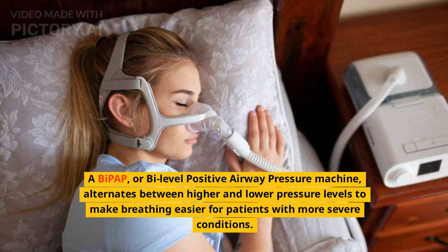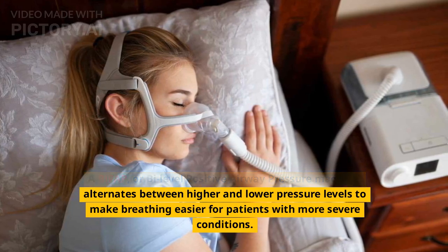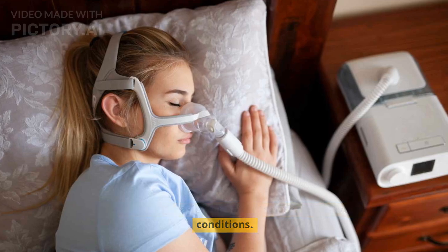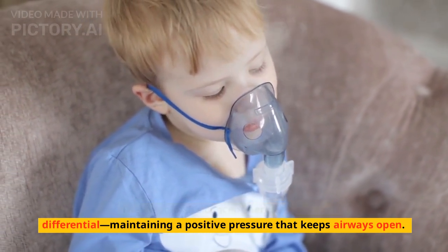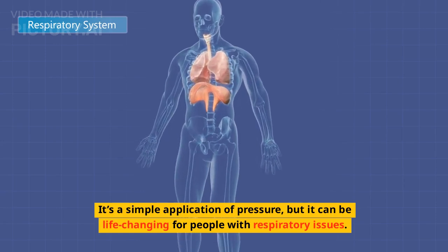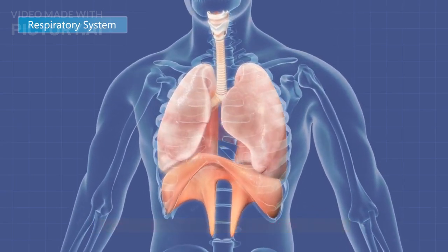A BiPAP, or bilevel positive airway pressure machine, alternates between higher and lower pressure levels to make breathing easier for patients with more severe conditions. The key physics concept here is pressure differential, maintaining a positive pressure that keeps airways open. It's a simple application of pressure, but it can be life-changing for people with respiratory issues.